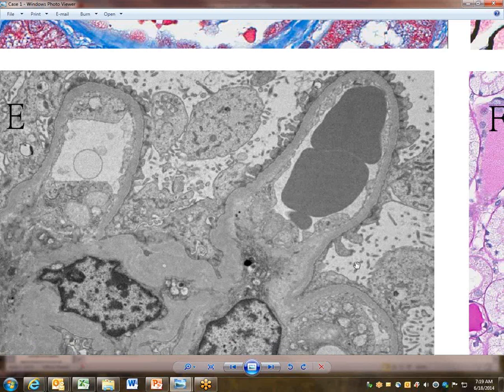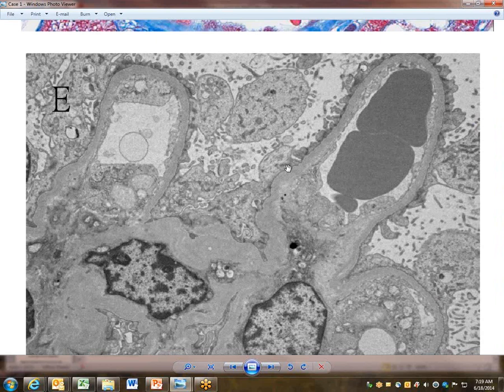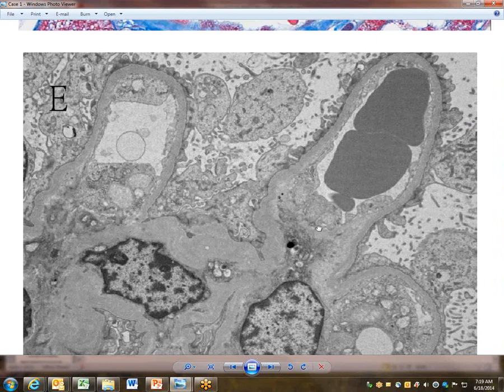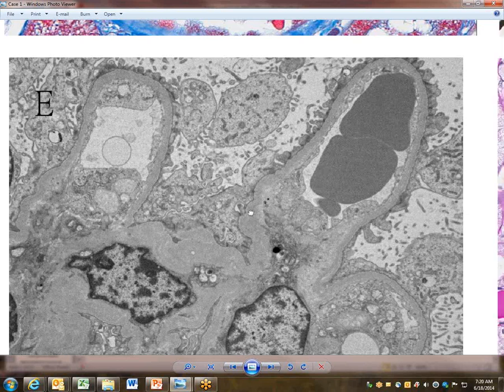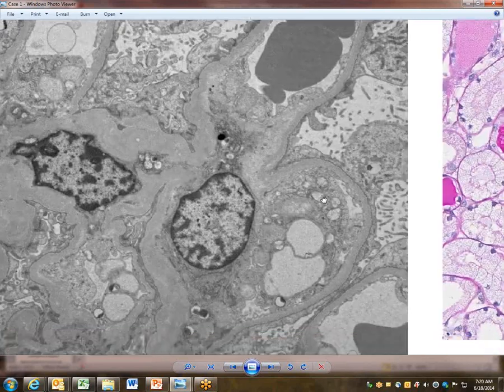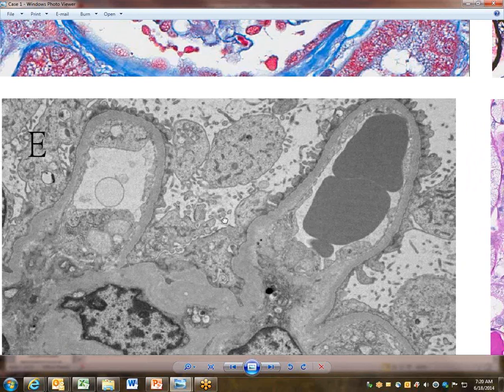some subtle densities near the glomerular basement membrane that might be immune deposits, and I mean things like this. And again, once you appreciate that the consolidation or condensation of actin filaments in the podocytes that are rearranging their cytostructure can end up making somewhat electron-dense regions. That explains most everything that even comes close to being a suggestion that might be misinterpreted as an immune deposit in this image, I think.